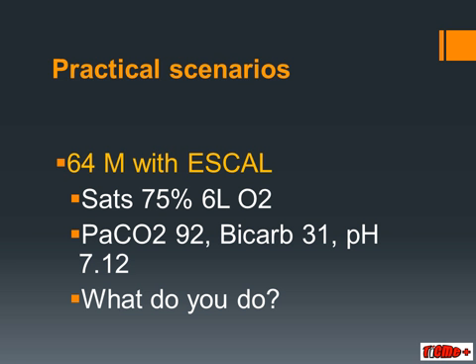In the patient who isn't immediately responding to therapy or is deteriorating, we need to institute non-invasive ventilation early, starting at the parameters of around 10 on 4 and titrating IPAP upwards to augment tidal volume and reduce work of breathing. You can give yourself 15 to 30 minutes for the patient to settle in to allow time to accumulate more information, such as whether the patient is for invasive ventilation intubation if they continue to deteriorate.